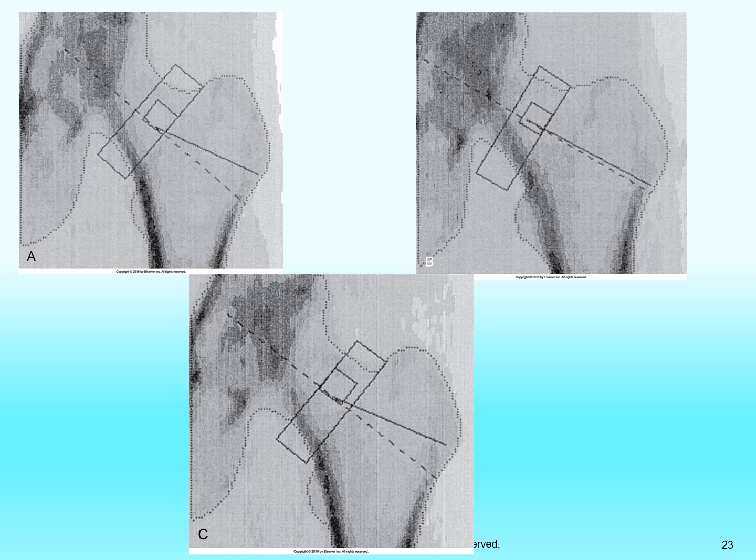You should be doing a slight internal rotation of the toe for a true AP of the hip, as was done in letter A. So when you're doing follow-ups, you always position the patient the exact same way. So letter B is an inaccurate measurement or an imprecise measurement because you don't have the bone positioned the exact same way as it was done the first time in letter A.